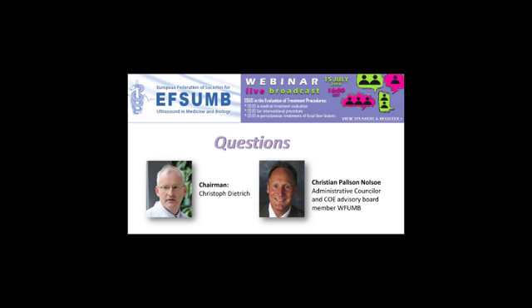I think it's very easy. The real advantage is that we do it real time. We can do it over and over again. If you missed something on a CT scan, you missed it. If you were too late with your timing, your gating, you didn't see the arterial uptake or whatever you looked for, you missed it. With CEUS, you can do it over. You can do it actually in the same infusion, in the same bolus, because you can do a burst bubble procedure by pressing high mechanical index, and you can see the arterial fill come in. Or if you're not able to do that, you can re-infuse again. So it's real time, and it's a possibility of putting your needle exactly where you want it at any angle.